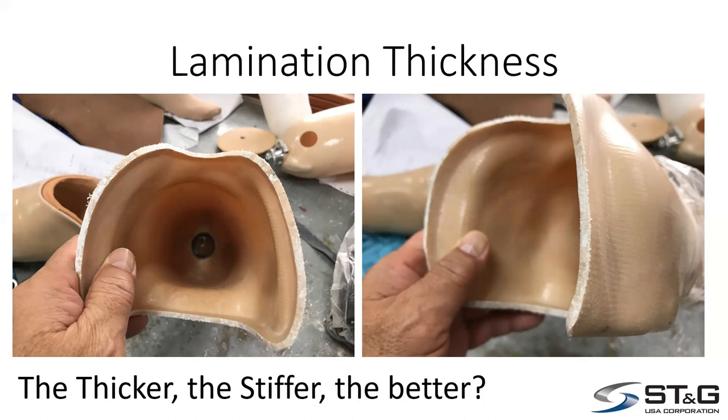The other thing is, if you look at the picture on the left, you can see by my thumb on the shelf where it's discolored. And when I looked closer into it, I saw that it was actually resin starvation. There were some air bubbles there. And also, if you look towards the bottom of the socket on the inside, you can see there is some lighter color on the bottom as well, and that is from the socket adapter that they laminated in. And it's very close to the surface on the inside. I've seen where some of these sockets have actually failed, where the component pushed inside because there's not enough reinforcement between that socket adapter and the inside of the socket. So those are some of the things we need to think about.